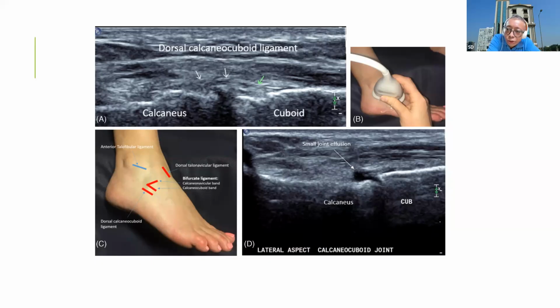So if you are using steroid, inject above and below the fusiform dilatation of the plantar fascia. If you are using PRP, see with the ultrasound image wherever there is more fusiform dilatation with associated anechoic area or loss of reflectivity of the plantar fascia, that is the site. That means at the site of attachment with the calcaneum. I'll show you in the picture.